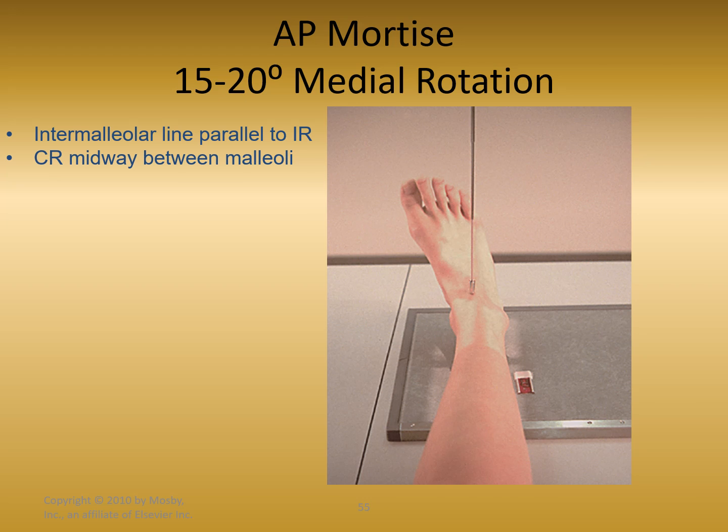Now, the view to open the mortise joint requires us to rotate the leg medially 15 to 20 degrees. In doing this, we will be placing the intermalleolar line parallel to the IR. So if we drew a line from this malleolus to this malleolus, we would end up with a nice line parallel to the IR.